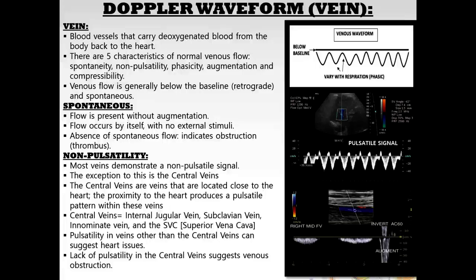So what does spontaneous mean? Spontaneous means the flow just happens. You don't have to squeeze a vessel to make the flow go anywhere. It occurs by itself with no external stimuli. If you don't have spontaneous flow, this can indicate an obstruction, such as a thrombus in the vessel.